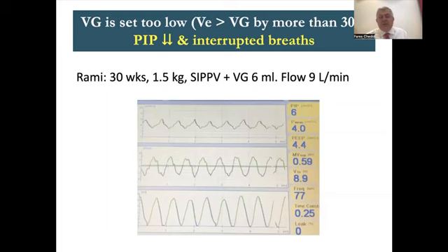So the solution for this case is not to extubate. Try to give him his 5 or 6 ml/kg. If he still wants 10 or 11 or 12 ml/kg, which they do sometimes, and you don't want to give it because it's unsafe, just take the VG out and please put the PIP up to 16 or 14, and he will calm down very quickly. His respiratory rate will go down to 40 and that gives you time to extubate him.